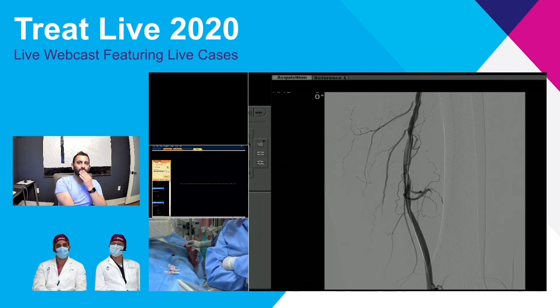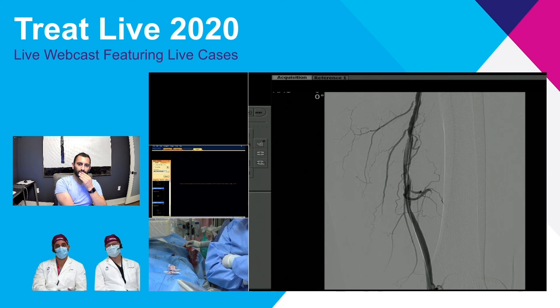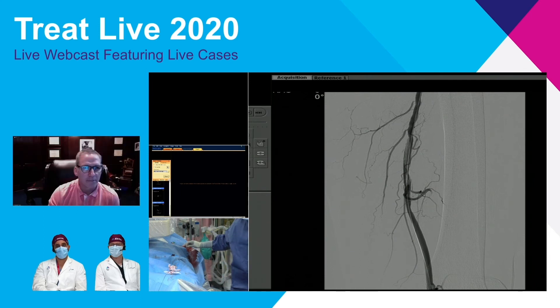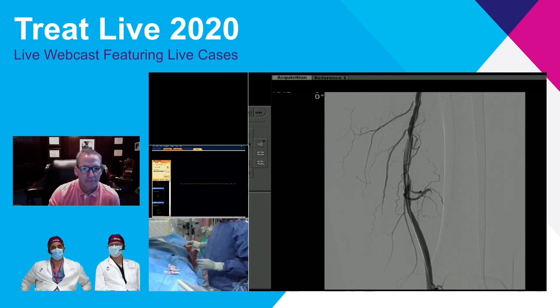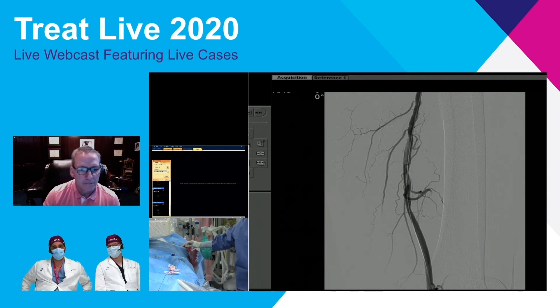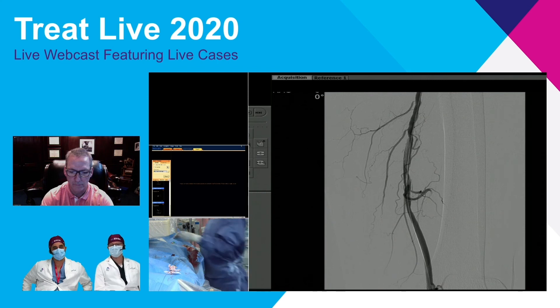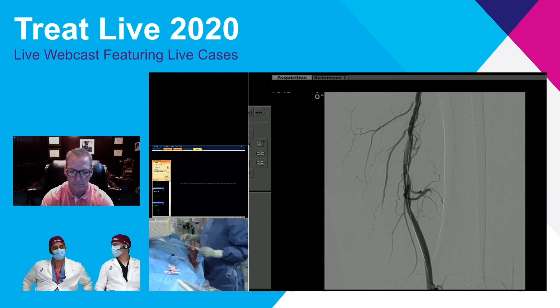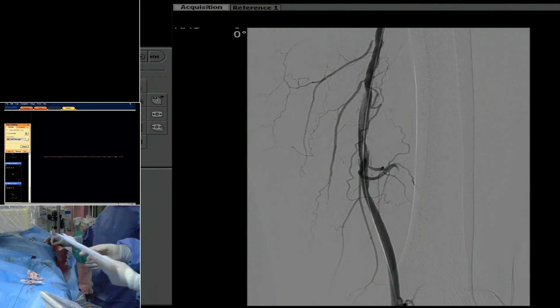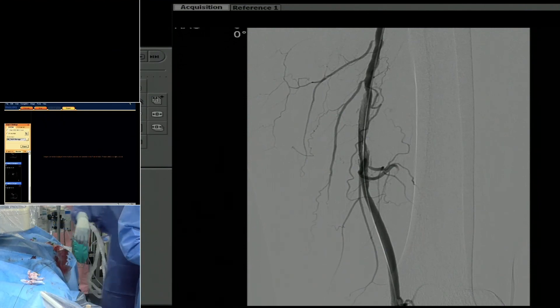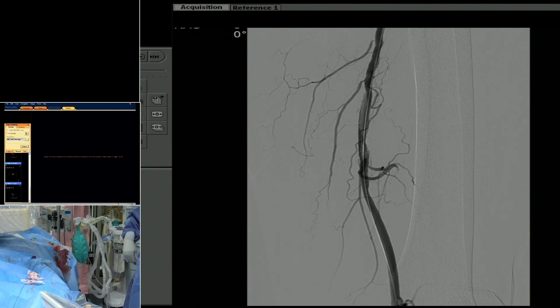We're deciding right now between a 6x60 Misago or a 6x100 Misago stent — I'm thinking just go with the 100. An 80 is probably ideal, but you don't want to end up short and have to put two 60s right across the canal. What's nice about this stent is its length — it's the longest SFA stent I know of in terms of shaft length for getting it down. The only other alternative is the Medtronic Everflex with the Entrust system. This is also Rapid Exchange, which is nice — but it's a self-expanding nitinol stent, like other bare metal stents used in this area.